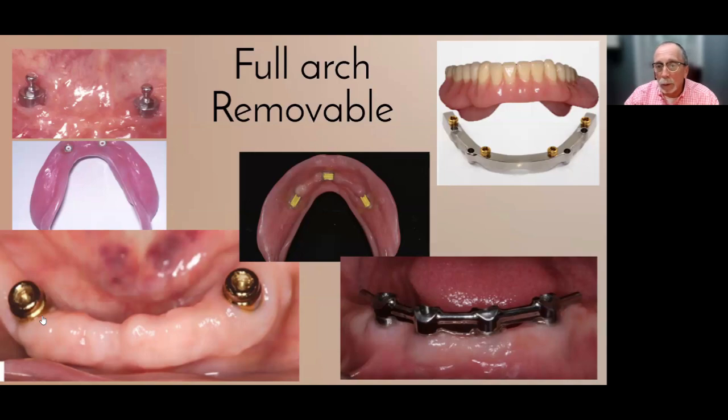And sometimes they're connected with a bar. Sometimes the attachment's on top of the bar. Sometimes it's a simple trailer hitch. Sometimes it's a clip. But all of these are what we classify as a removable full arch implant device.